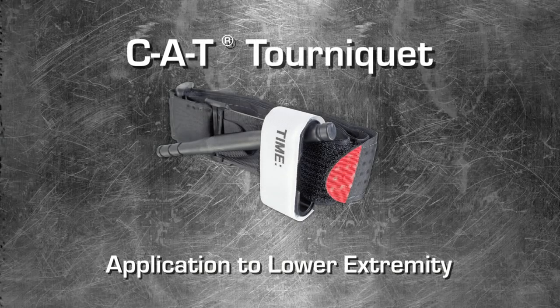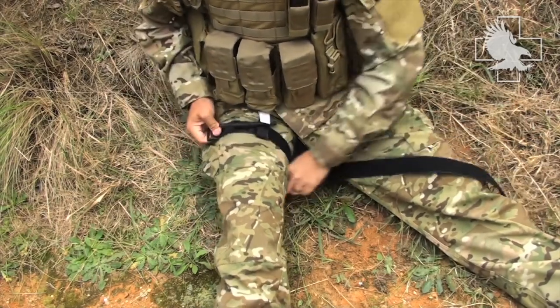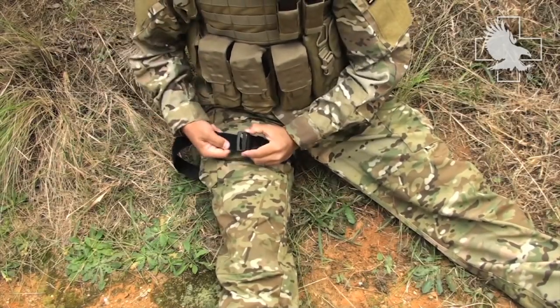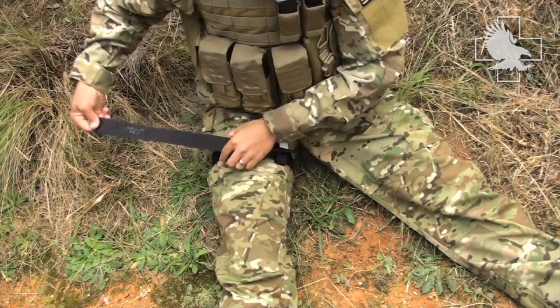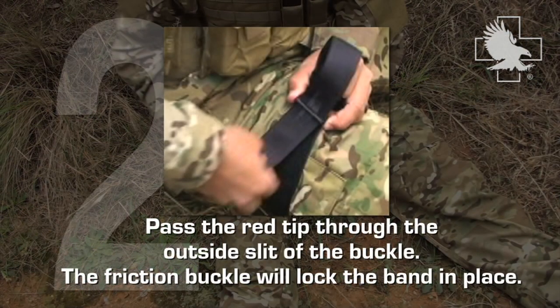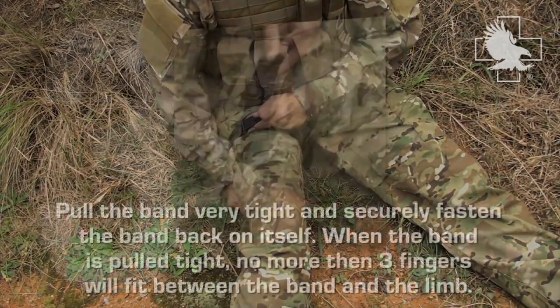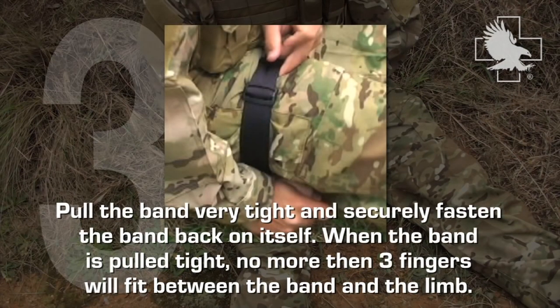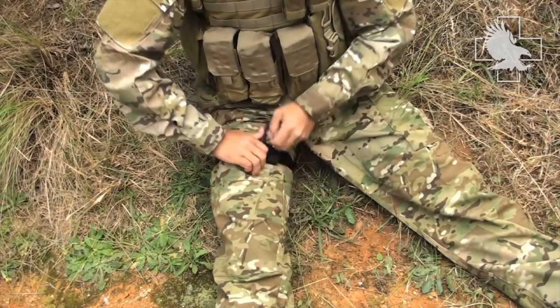Welcome to the CAT tourniquet video tutorial, application to lower extremity. Route the band around the limb and pass the red tip through the inside slit of the buckle. Pull the band tight. Apply tourniquet proximal to the bleeding site. Pass the red tip through the outside slit of the buckle. The friction buckle will lock the band in place. Pull the band very tight and securely fasten the band back on itself. When the band is pulled tight, no more than 3 fingers will fit between the band and the limb.